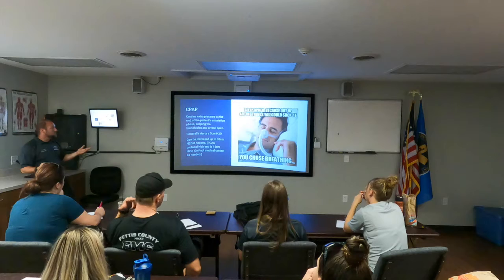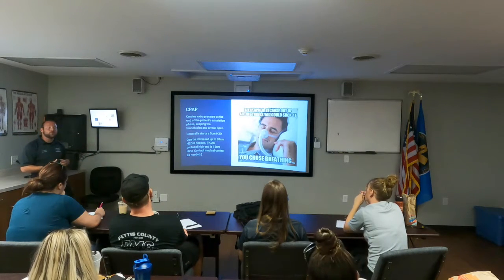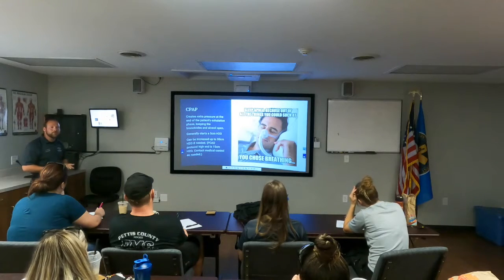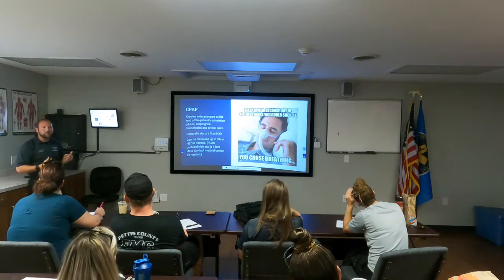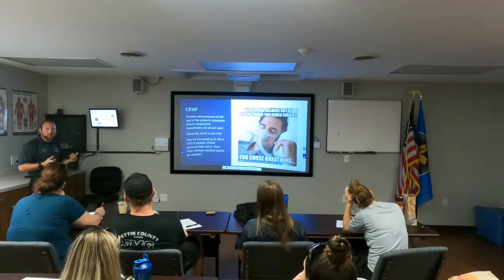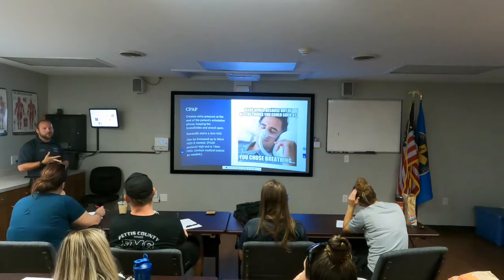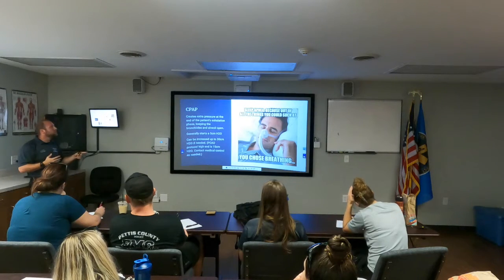So for CPAP, the biggest thing we're going to go with, again, we're talking about our CHF patients or people who have type 1 respiratory distress. So these are going to be people who have lung injury. They're going to have problems more of oxygenation than ventilation. These individuals are going to be the ones that have CHF, pulmonary edema, and a couple other ones which we'll go over in a little bit.